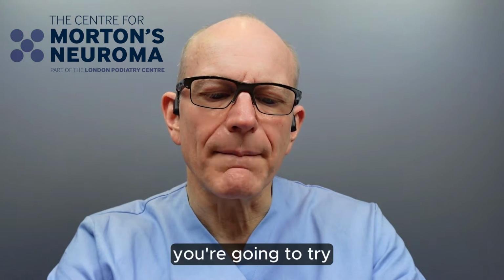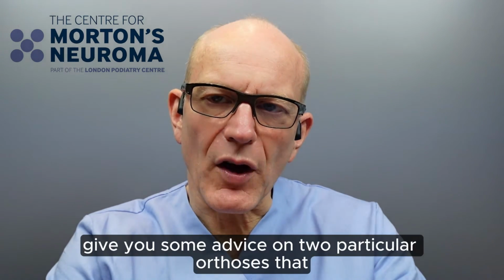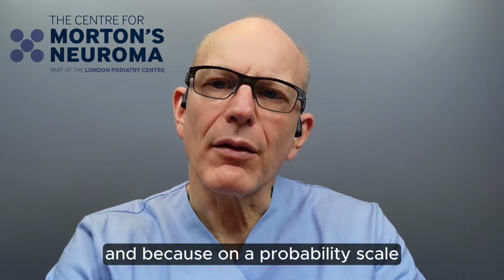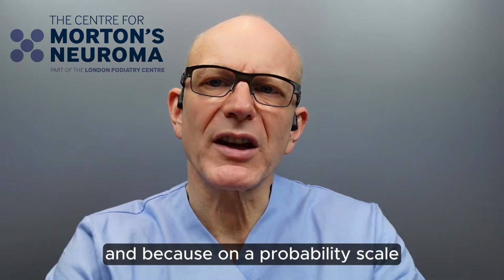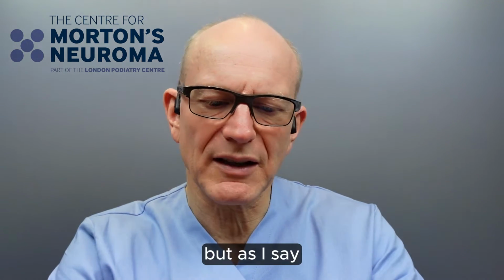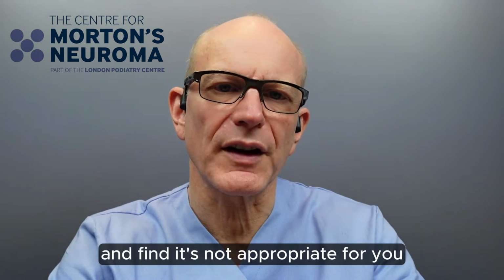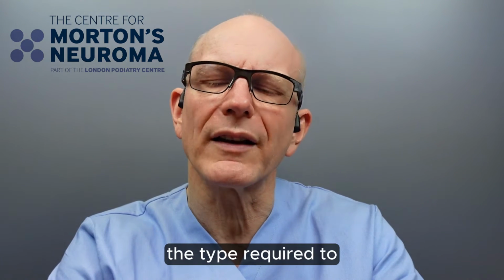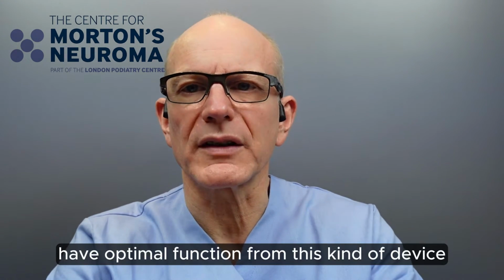The whole point is that it's a generic device, so it can't possibly be right for every foot. So it's really just a case of hoping that your foot shape is suitable for the type of orthotic that you're going to try. But I just wanted to give you some advice on two particular orthoses that I like and that we like within the center for their resilience, and because on a probability scale there is a bit more chance that they will work for a larger percentage of the population. But as I say, you could easily order a device like this and find it's not appropriate for you just because your foot shape is different than the type required to have optimal function from this kind of device.